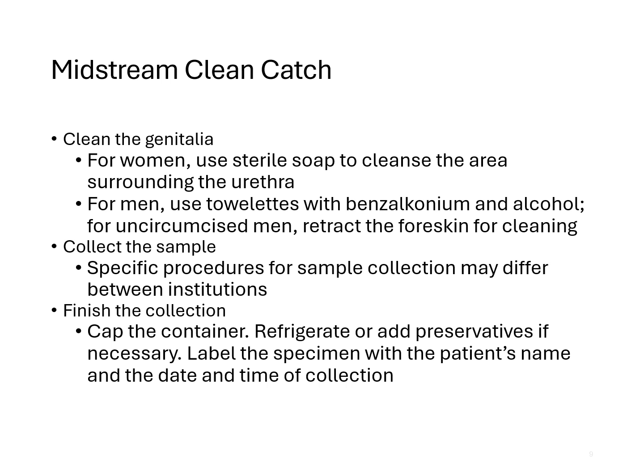They're going to cap the container, make sure that it is labeled with the patient name, date of birth, time of collection, and date of collection as well.